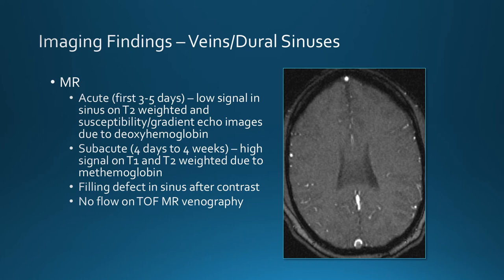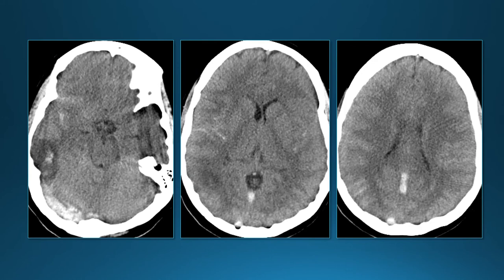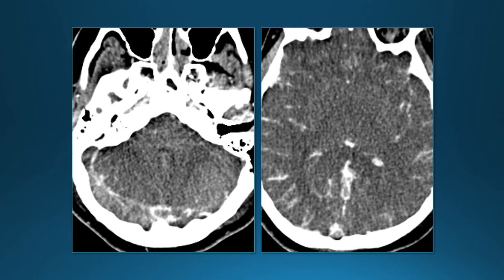Time-of-flight MR venography shows no flow within the thrombosed sinus — here you can see absent flow within the sagittal sinus. On CT, this non-contrast image shows high density in the transverse sinus and also in the straight sinus, with a post-contrast filling defect and no enhancement within the thrombosed sinus — this is the empty delta sign.